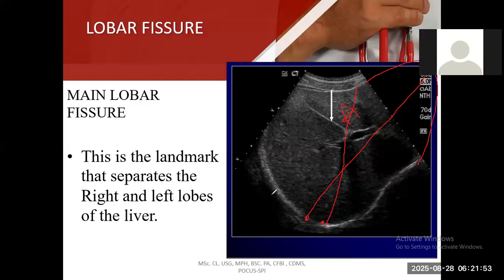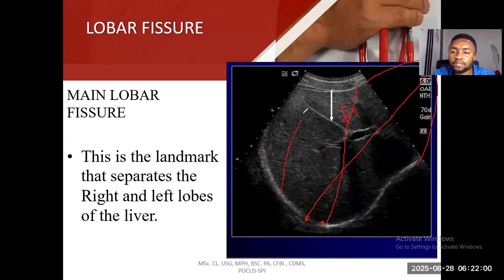Do you understand? So that's why I showed you some images earlier where most of the right lobe didn't show. All this part was cut off. And in that one, you get the image in a way that the left lobe will be shown, so that you can measure that one in addition. But in this one, almost all the right lobe is seen. So you cannot measure the full right lobe to the left lobe like that. You overestimated.